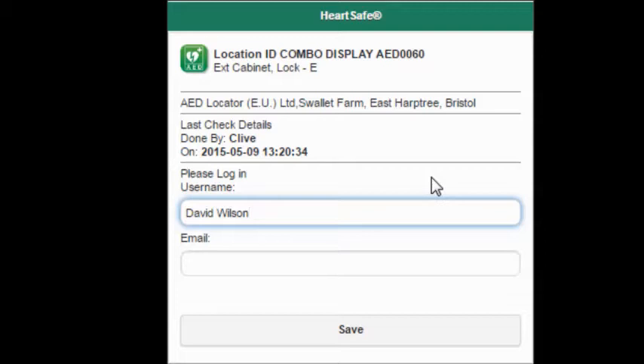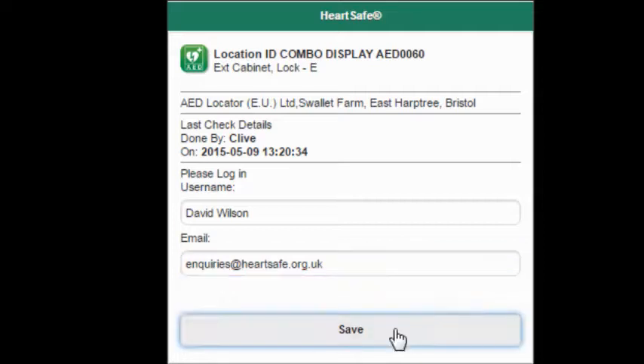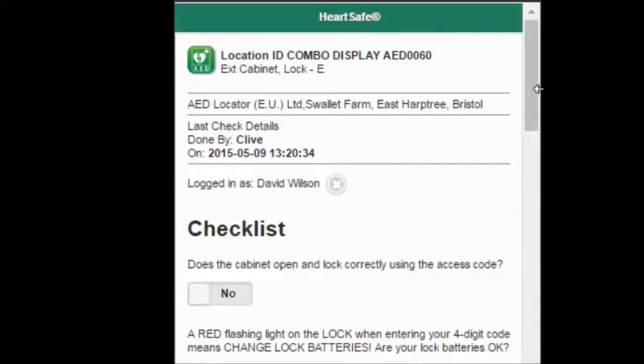If you have a mobile data connection, it will take you directly to the login page where you log in with your username, which is simply your name, and then your email address. Once you hit save, this will be saved on your phone, PC, or tablet and you should only have to enter this the first time that you use the system.